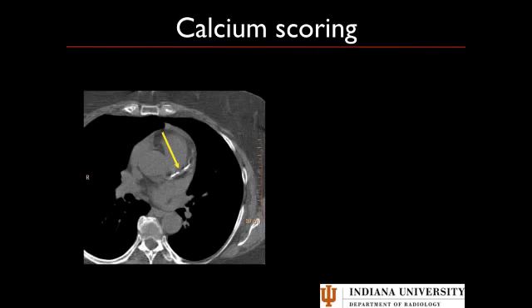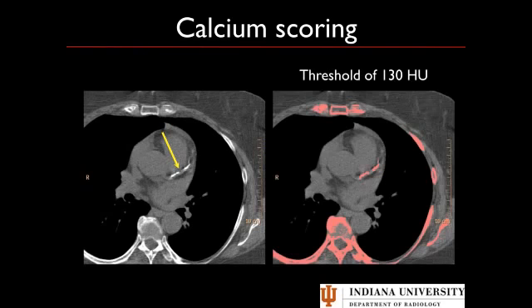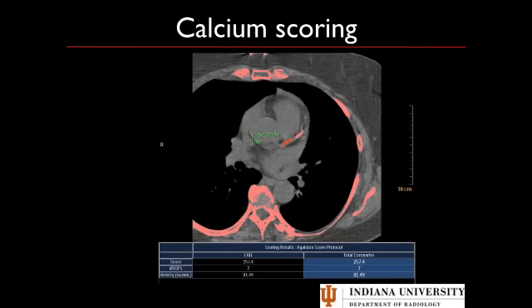Here you can see an axial image with calcification in the LAD. We turn on the highlighting and it will highlight anything with a Hounsfield unit greater than 130. The computer highlights the calcium within the vessel, then we click on it and it calculates the area. Anything contiguous — superior and inferior, cranial or caudal — it will also highlight. If there's too much disruption between areas, it won't bridge that gap, so you'd click separately to score it. As you score each one, it adds up. Here we've shown this is in the LAD; here's the score based on the area — that's an Agatston score.